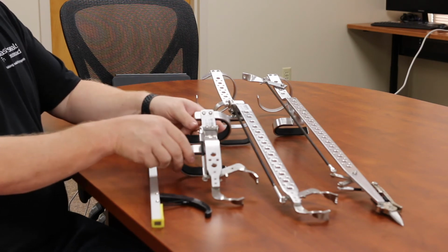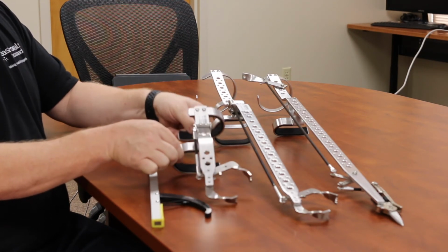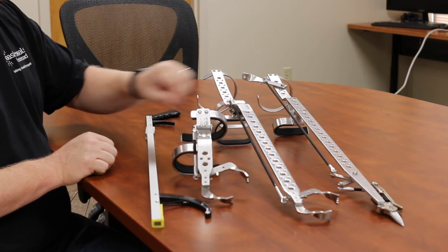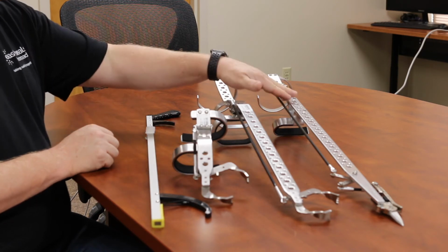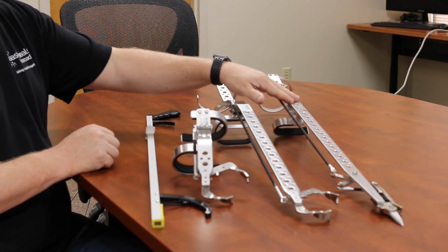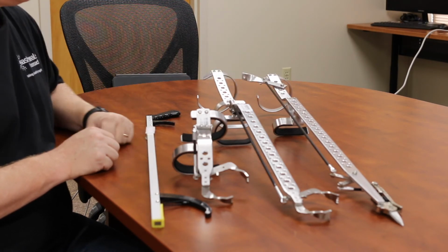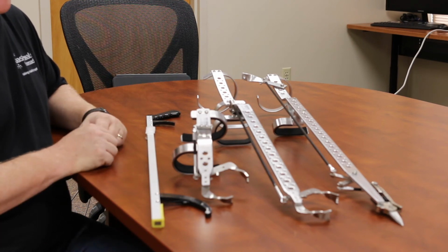And so I'm going to hold up the mini reacher. We've got three things here. We've got the mini reacher, which is a smaller device. We've got the longer reacher or traditional reacher, which is a lot longer. It's going to allow you to pick up things that may have fallen on the ground or those types of things. Then we have over here, this is an interesting one. It kind of looks like a switchblade on the end, but it's actually a pair of scissors. And so you can use it to cut and do some other kinds of things. But they're all activated in almost the very same way.